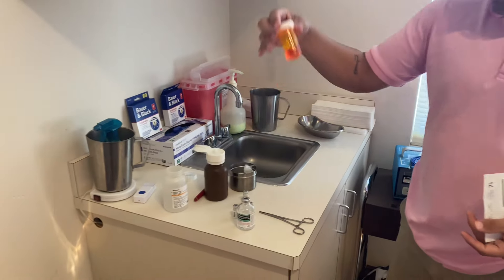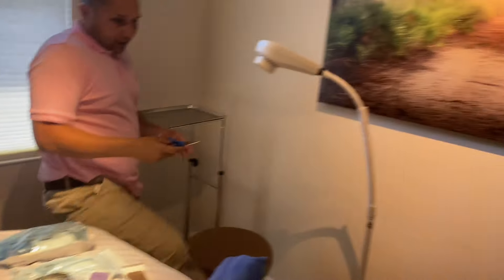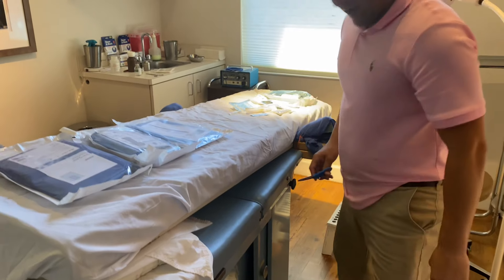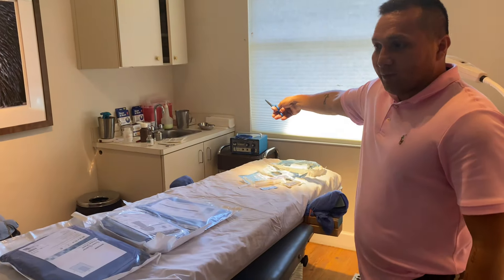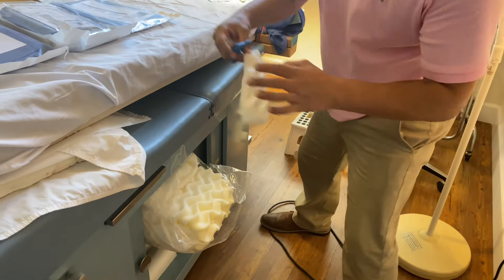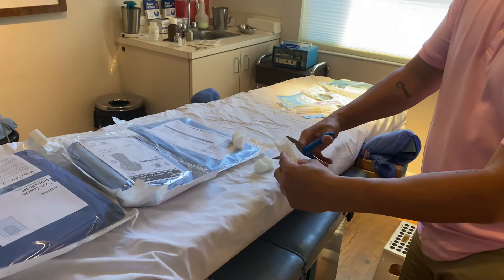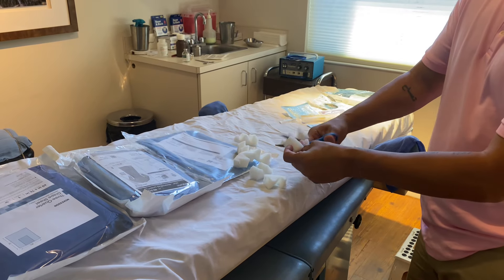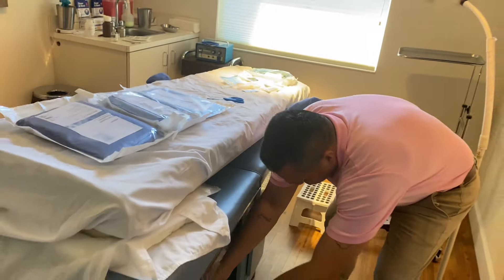We do require extra padding. Dr. Stein uses this — I'm not entirely sure what he uses it for, but it's always been here. I think this is what he uses to wipe down and clean the patient. As you can see, we have padded material and we just cut about an inch of it. We'll have enough probably for the remainder of the year. You might want to ask him what the purpose is, but I know he uses it. The padding is right under the bag.